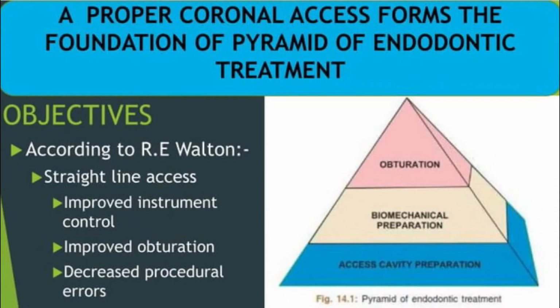So, what are the objectives of access cavity preparation? Proper coronal access forms the foundation of the pyramid of endodontic treatment. According to Walton, there should be straight line access to the apical foramen, improved instrument control, improved obturation, and decreased procedure errors.